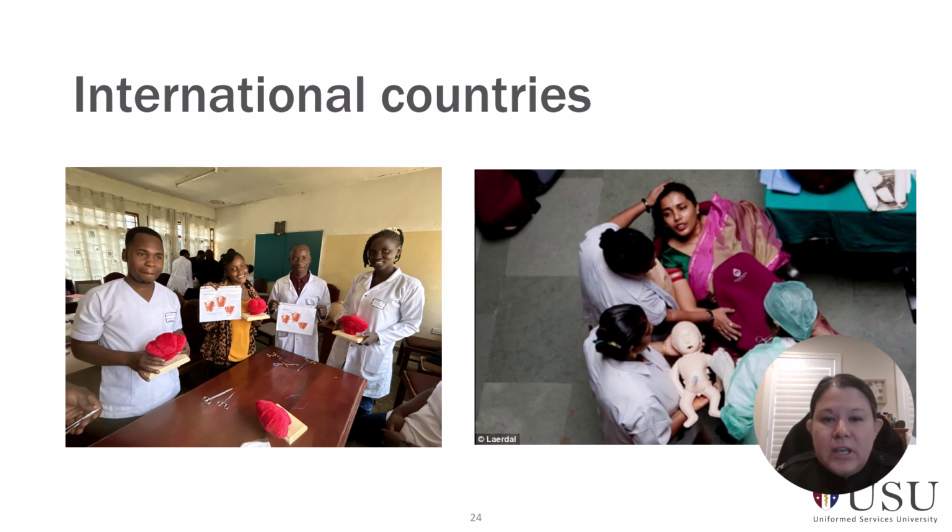And then how does this look in international countries? So a lot of the simulators that Laerdal develops, including the Mama Natalie, which is the wearable birthing simulator, can be used in developing countries. And that was some of the intent behind why they developed those, since they would be low cost and would be effective in teaching people about how to respond to obstetric emergencies.